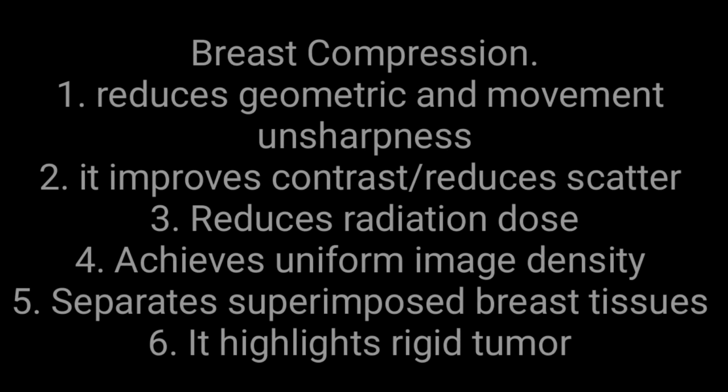During mammography, breast compression is used. This is used to reduce geometric and movement unsharpness. This is one reason for the breast compression. The second reason is that it improves contrast, and it also reduces scatter. So contrast would be improved by reducing the scattered radiation, and it also reduces radiation dose.